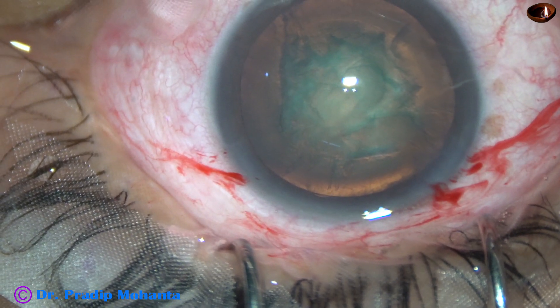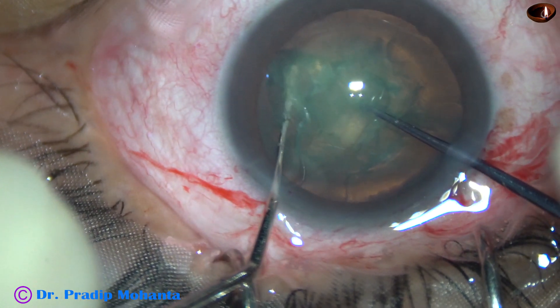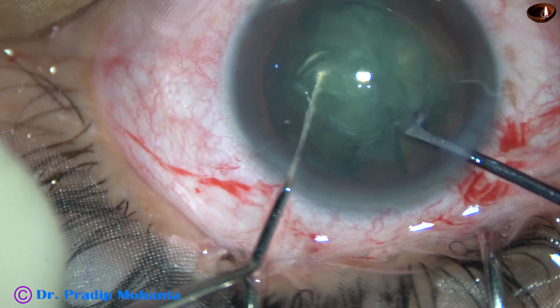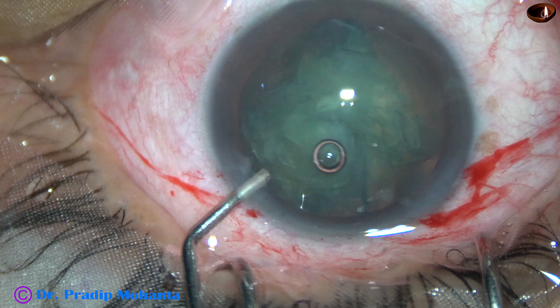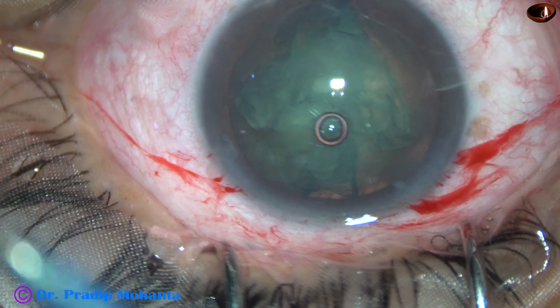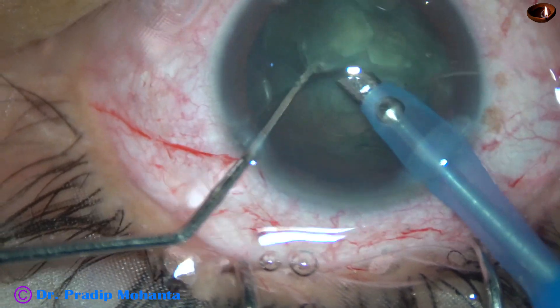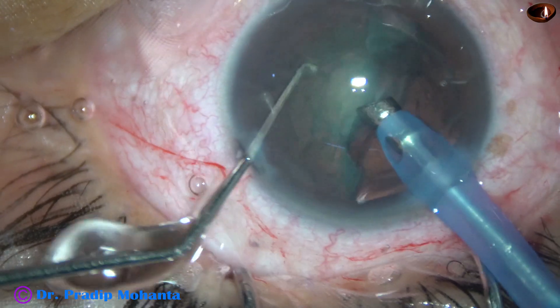Now I am going to divide this nucleus using a pre-chopper. The pre-chopper is in the right hand and the sustainer in the left. The two instruments come toward each other and it is pre-chopped. Turn 90 degrees and pre-chop again. Then inject some more viscoelastic and introduce the tip of the phaco needle bevel down. Some superficial cortical lens matter is removed.